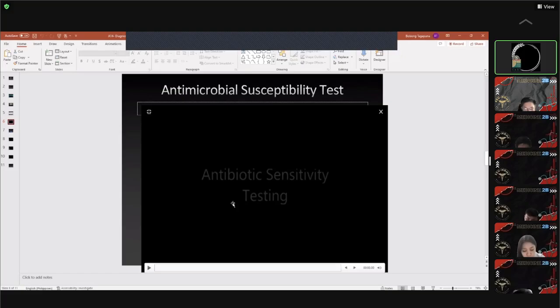If there is an inhibition, meaning there's no growth around the antibiotic disc, the bacteria is sort of scared to go in or are inhibited. And then the zone of inhibition will be measured, and that will tell you there's a cutoff. There's an established distance or area covered for you to surmise that it is sensitive. This is in vitro.